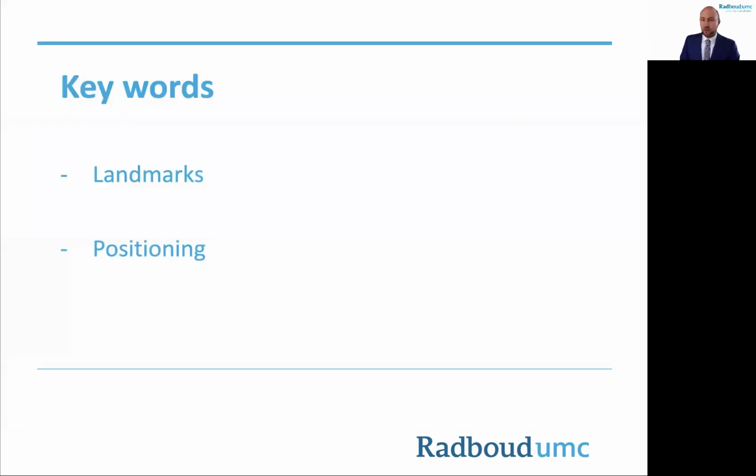In this last slide, I would like to highlight that landmarks will always lead you the way, and the right positioning of the patient makes scanning a lot easier. In this presentation, I discussed the anatomy and scanning technique of the sciatic, femoral, and saphenous nerve. I want to thank you for your attention, and hopefully you enjoyed it.